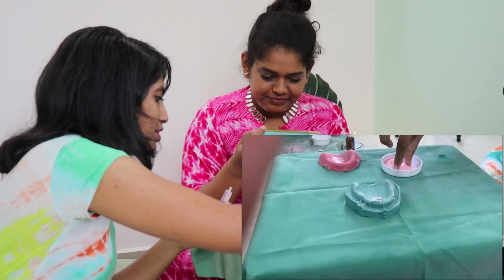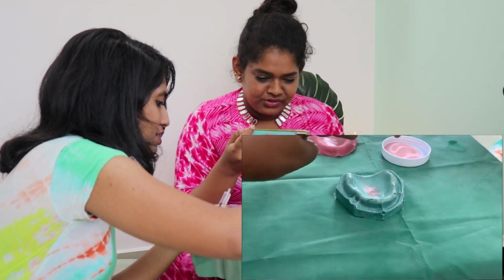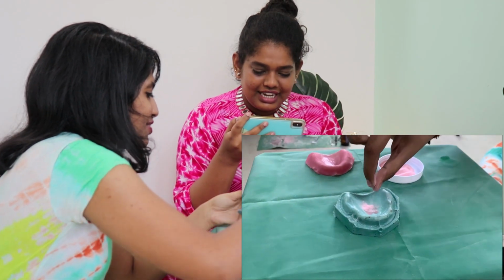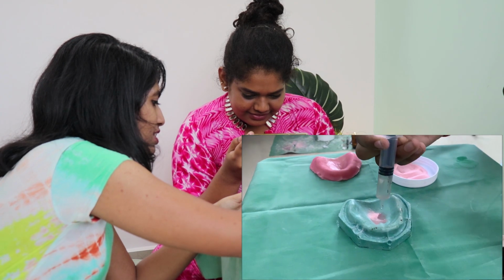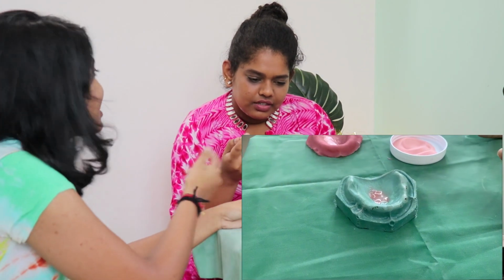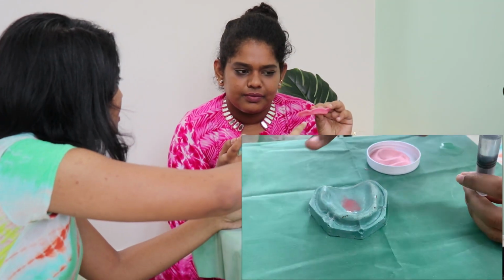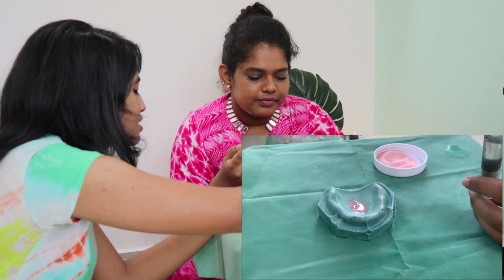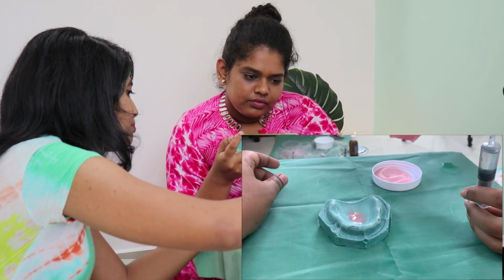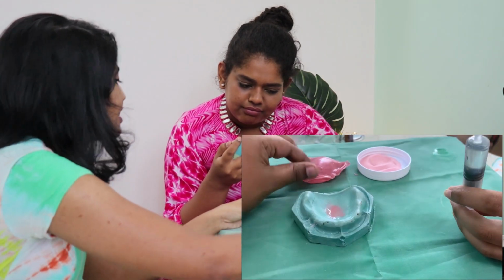Right. So you take the powder, you put it like that. What does this do? Then you need to put the liquid. See, both of these have different compositions. It just hardens to become like that. What it does is it will take the shape of the cast, in the imprint, but throughout it should be the same thickness.